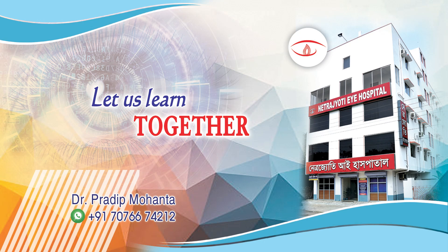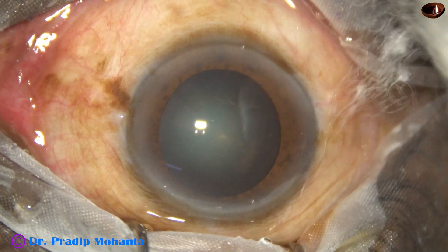Friends, welcome to my workplace at Rana Ghat, West Bengal, India. Let us observe this totally unedited phacoemulsification.